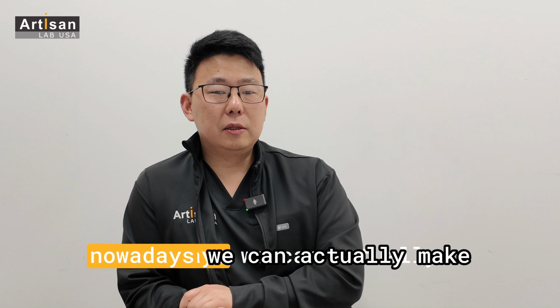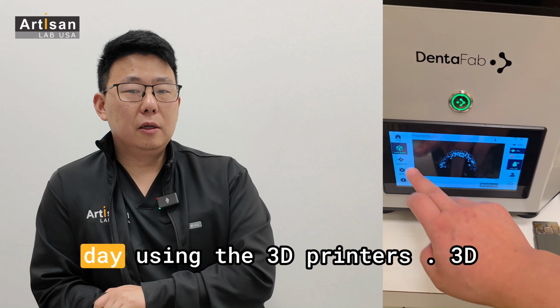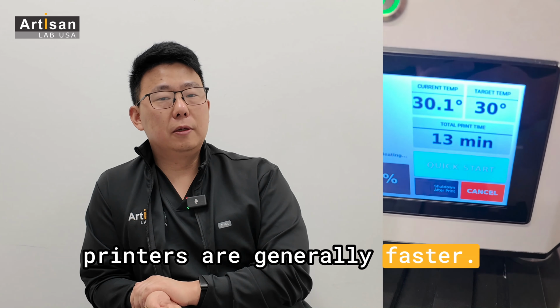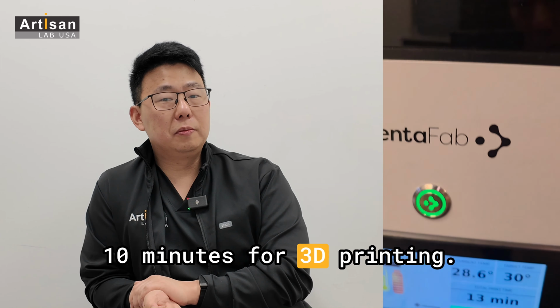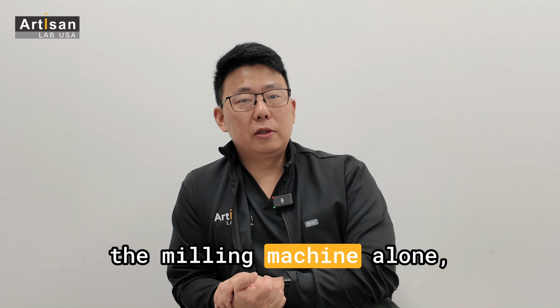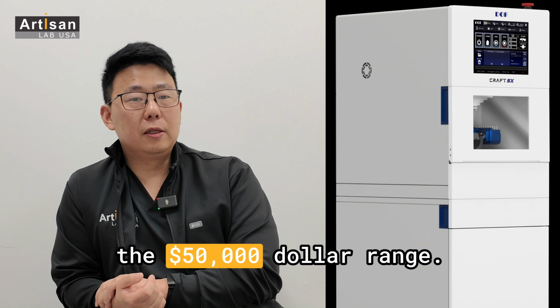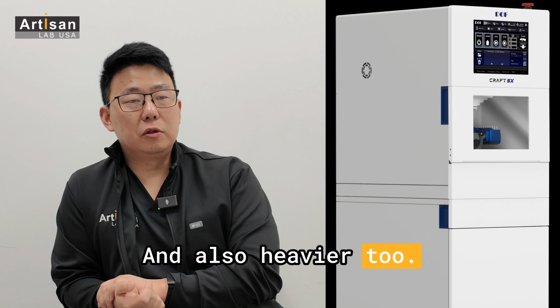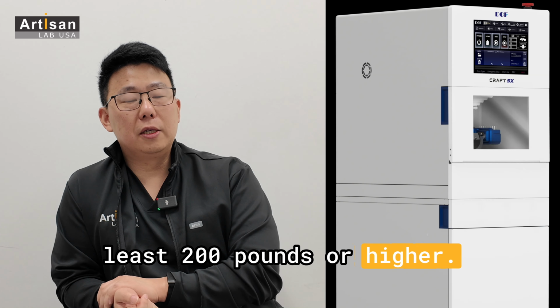But nowadays we can actually make those dentures on the surgery day using 3D printers. 3D printers are generally faster. It takes 15 minutes, sometimes 10 minutes for 3D printing. The milling machine alone costs a lot more, in the $50,000 range, and it's also heavier. We're talking about at least 200 pounds or higher.